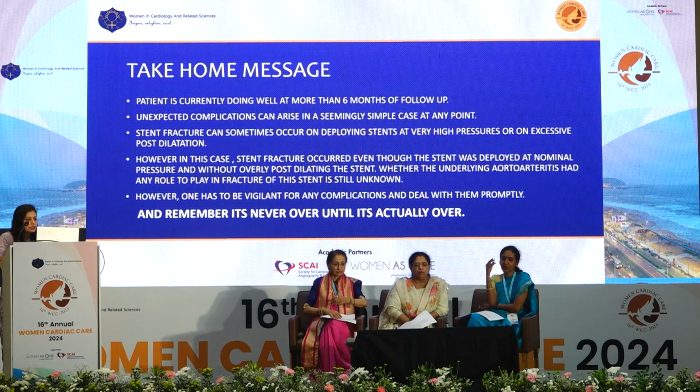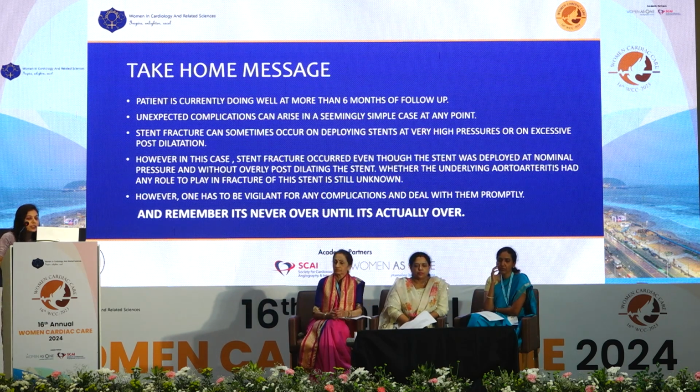As we can see, in a seemingly simple case, unexpected complications can occur. Stent fractures can sometimes occur on deploying stents at very high pressures or on excessive post-dilatation. But in this case, the stent fracture occurred even though the stent was deployed at nominal pressure and without overly post-dilating the stent. Whether the underlying Takayasu arteritis had a role to play in this fracture is still unknown. We didn't have any other imaging available for this. So we put in a new stent, post-dilated, and currently the patient is doing well.